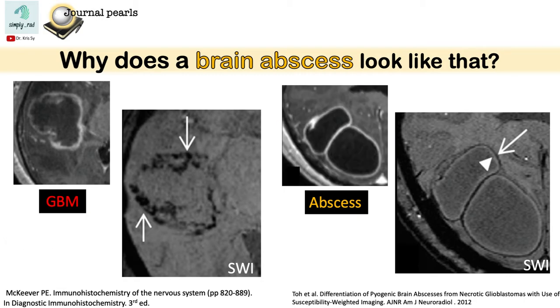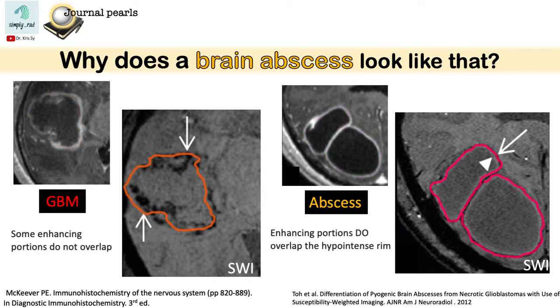Let us look at another difference between the two. If we draw a line along the enhancing portion of the lesion and overlay it on the SWI image, on the abscess, the enhancing rim overlaps with the hypo-intense rim. While in GBM, there are portions of the enhancing rim that do not overlap with the hypo-intense rim. So that is another clue to differentiate GBM from abscess.